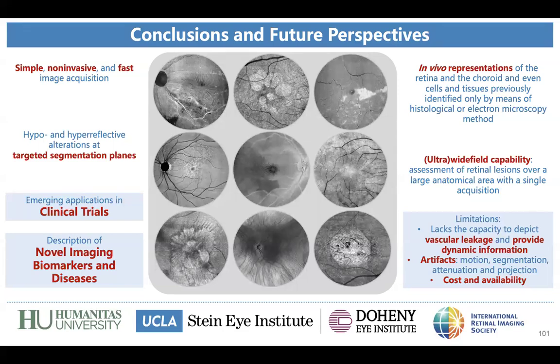To the best of my knowledge, usually the agreement is not so high across different software and devices. Also, this type of artificial intelligence system performs well, but not yet at the level of an expert physician, of course. In my opinion and experience, the best they can achieve is around 60 to 80%, not more. It's very difficult to go beyond 80 or 90% of reliability and accuracy.